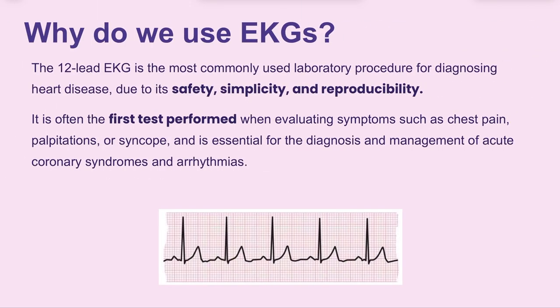So why would we use something like this? Well, put very simply, it is the most commonly used laboratory procedure for diagnosing heart disease due to its safety, simplicity, and reproducibility. This is often one of the first tests performed when evaluating for symptoms of chest pain, palpitations, or syncope, and it's essential for the diagnosis and management of acute coronary syndromes and arrhythmias. We see EKGs across the healthcare field, from the emergency department to the cardiologist clinic to cardiac rehab to exercise physiology and so on and so forth.